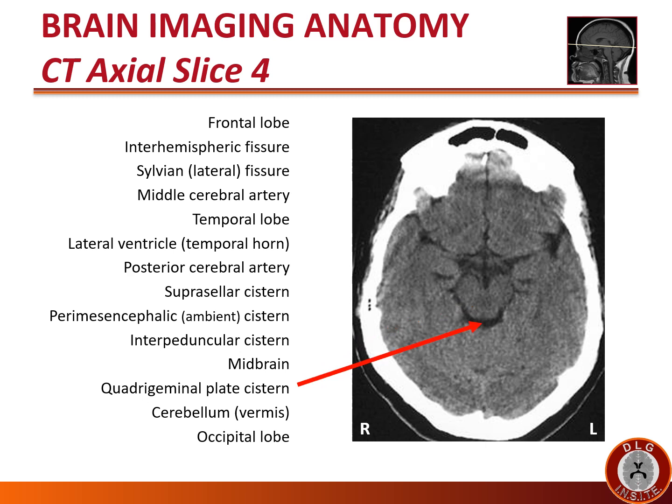Still at this level we see the CSF space dorsal to the midbrain called the quadrigeminal plate cistern. At this level we see the parenchyma right behind the midbrain and behind the quadrigeminal plate cistern — that's still part of the cerebellum. The central part of the cerebellum is called the vermis, which literally in Latin means 'worm.'